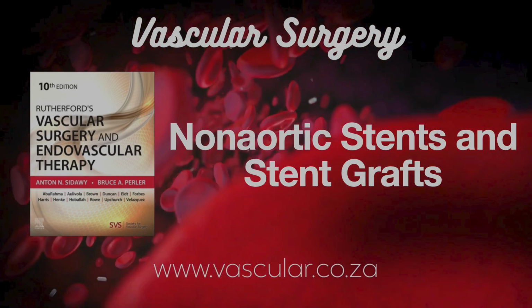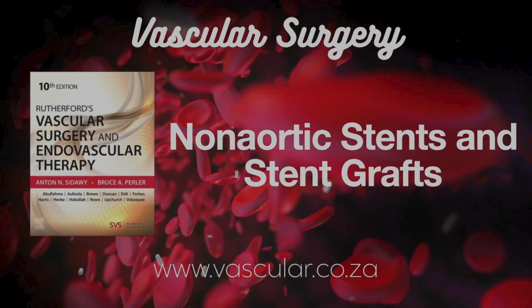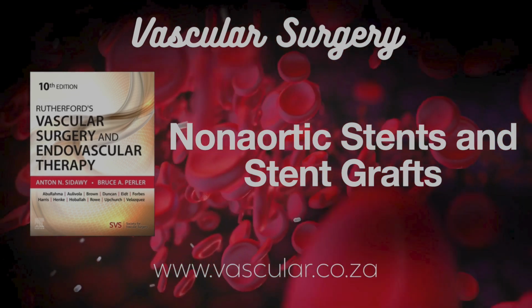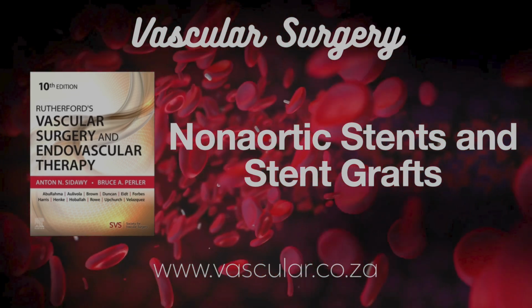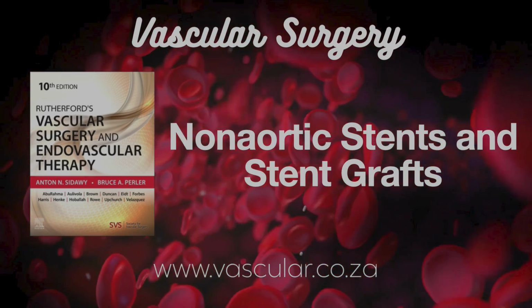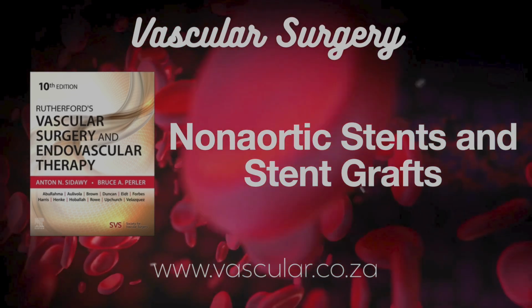Where the artery is located matters hugely. Think about arteries near the collarbone or in the neck. They can get squeezed by muscles or bones during movement. So you need something that can withstand that. Exactly. SE stents, being more flexible and resistant to compression, are usually the go-to choice in those mobile areas to avoid getting crushed or kinked. A stiff BE stent just wouldn't hold up well there.